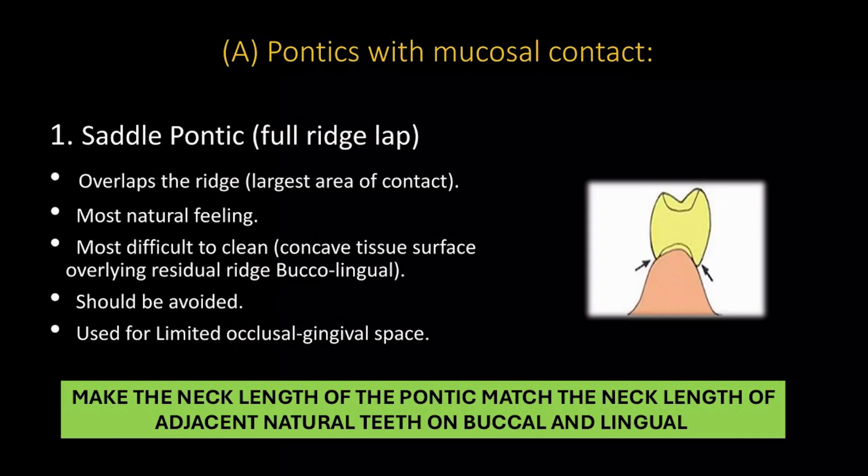This is our saddle Pontic. You can see that on the buccal and lingual, the neck of the tooth goes down over the turn of the ridge, meaning that it's very difficult to clean that. It's almost impossible to clean it correctly. I'm going to go back to one of the first slides and I'll show you.